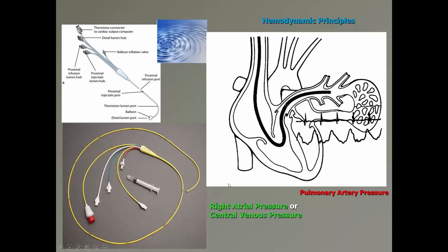Now, what are the ports that we have? Well, conveniently, they are color-coded. So this helps us to identify the location that this port sits in. So let's talk about the blue port first. All right, so here's the blue port.